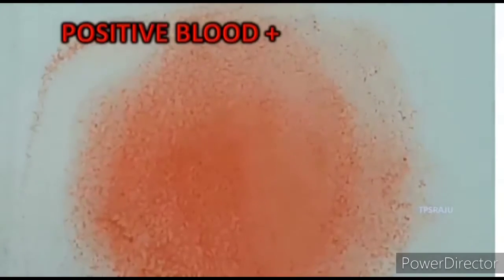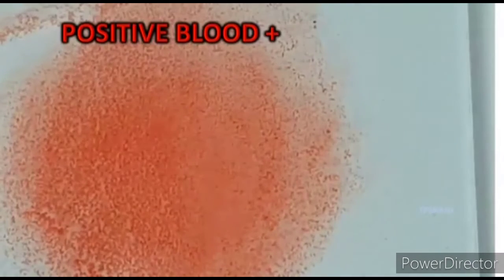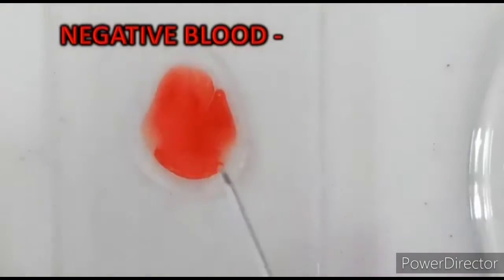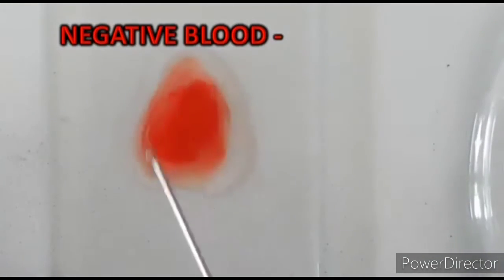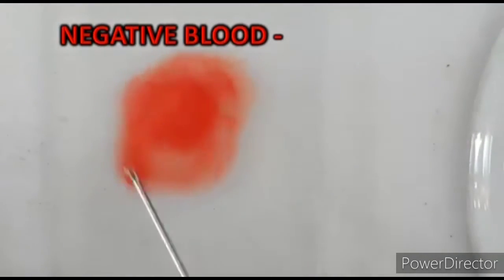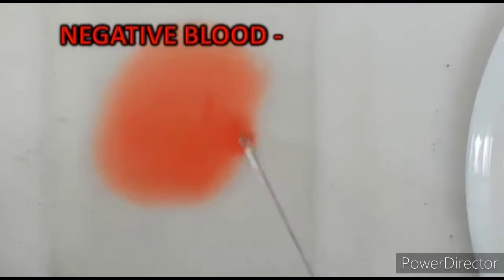Suppose you are taking a person's blood from group A, and it gets agglutinated in this serum D, then it is known as positive. If it doesn't agglutinate in that serum, then the blood group has RH factor negative, meaning the blood doesn't contain any RH factor. I hope you understand about blood groupings with RH factors.